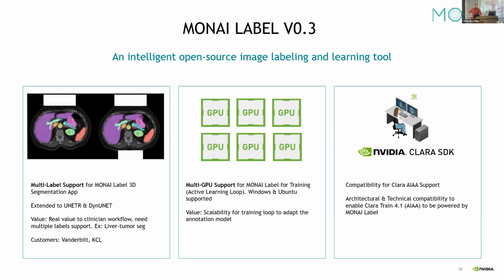Is there any higher level approval like FDA or full diagnostic use in humans? I believe if a company wants to get something FDA regulated, Monai is part of that package to get regulated, but Monai itself is not FDA regulated. So it's like the algorithm and its derivative works from Monai that face regulation. Correct.